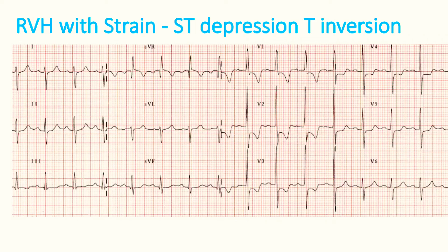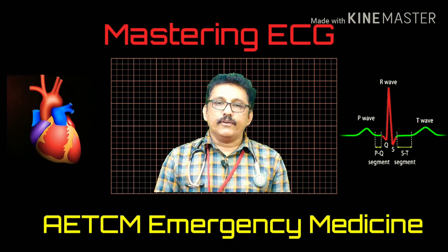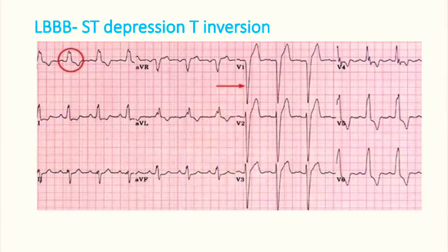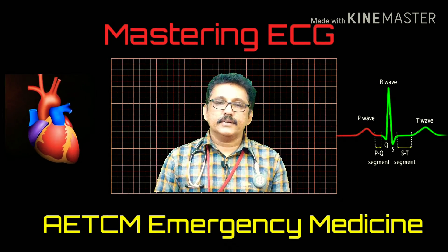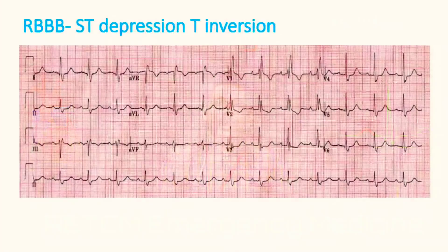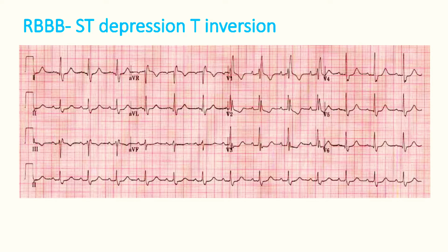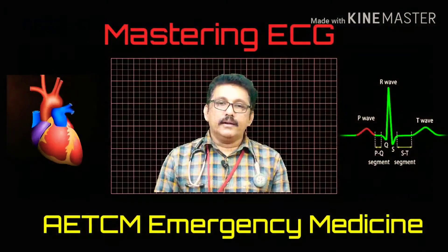In left bundle branch block, you can also see ST depression and T-wave inversion. In V4, V5, V6 you can see a wide QRS complex with an M-pattern, then ST depression, then T-wave inversion. T-wave inversions are seen in V5 and V6 in left bundle branch block. RBBB also can produce ST depression and T-wave inversion — in this ECG you can see the RSR' pattern in V1, V2, V3, and in V1 and V2 there is ST depression and T-wave inversion.